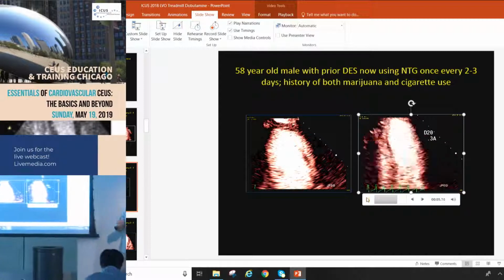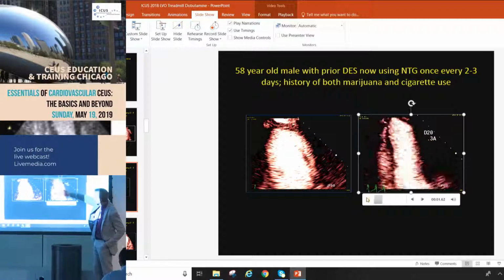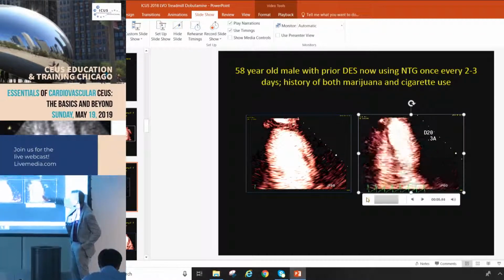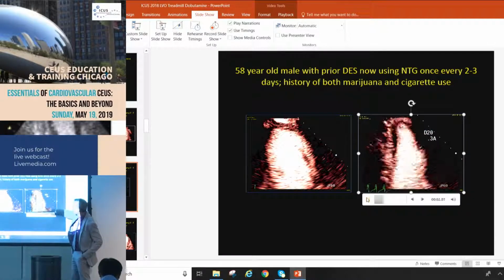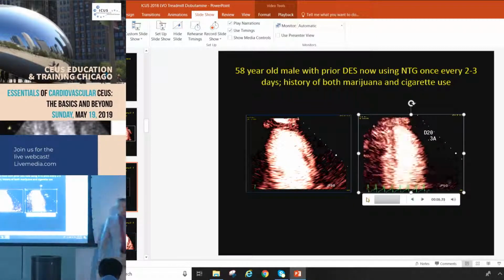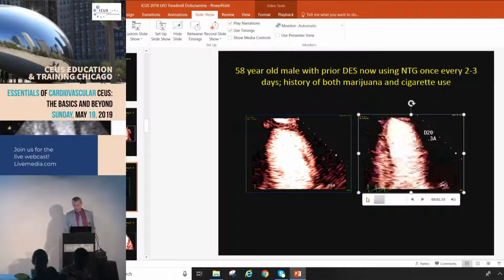But again, why can we see that? Because when we give that high MI impulse, we clear the subendocardium. So suddenly now you're just looking at that subendocardial border, not the whole transmural border. And remember, that's where ischemia occurs, in the subendocardium. And so now we see that little subendocardial layer that's not thickening. And so we said it was inferior and anterior and apical.